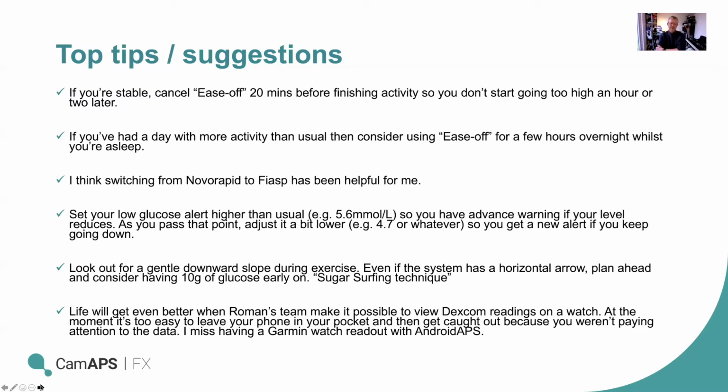There really isn't much more that I can say other than that. For me, CamAPS FX works very well for exercise. It continues to work better the more I learn about the way I respond and tweak things, like knowing when to ease off and when to have a bit of sugar. And yeah, I think it's great. I'll be very happy to stick around and answer any questions you have in the chat or after everyone else has presented. So thank you very much, and over to Sarah.